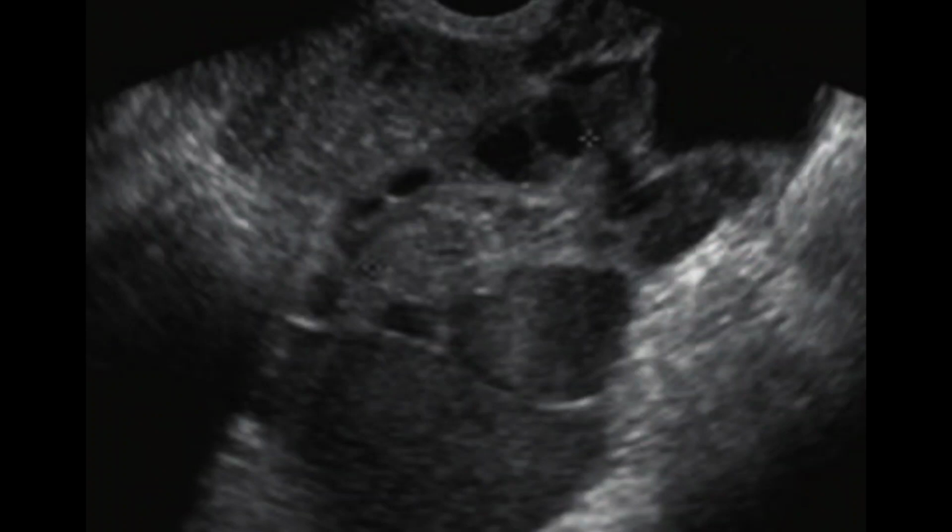Another important point is that you should put a Doppler signal on it and look for vascularity within the mass area, within the ovary, in the wall of the fallopian tube, and in the surrounding area. If there is vascularity, this adds to the information, and this would be a confirmed diagnosis that this tubo-ovarian mass is suggestive of pelvic inflammatory disease.